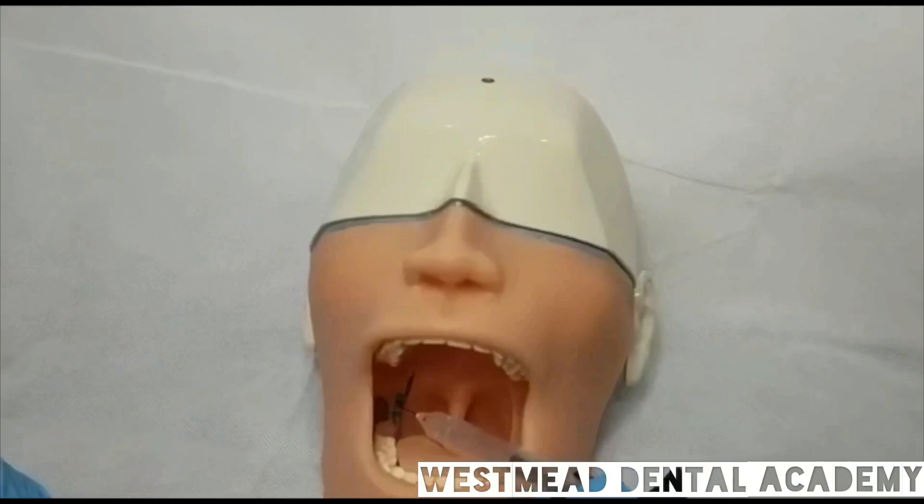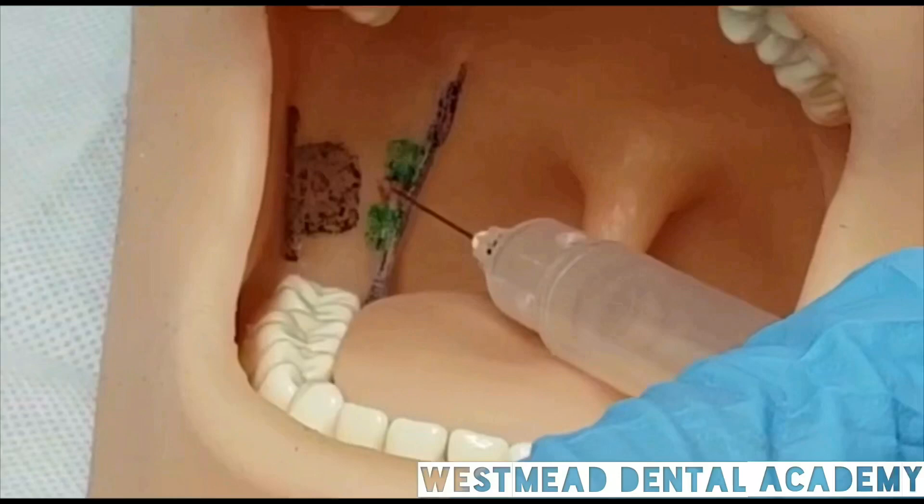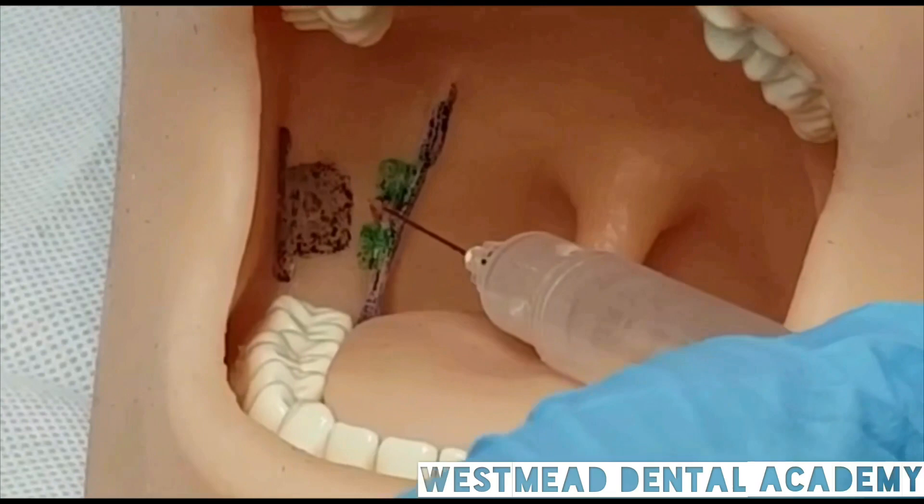Again, please remember that the entry point — which is the red point — should be about 1 to 2 millimeters away from the pterygomandibular fold, not 4 to 5 millimeters away as in the patient's mouth. I hope that this video helps you, and all the best for everyone, and my best wishes. Please, guys, if you have any questions, you are welcome to ask me. Thanks.